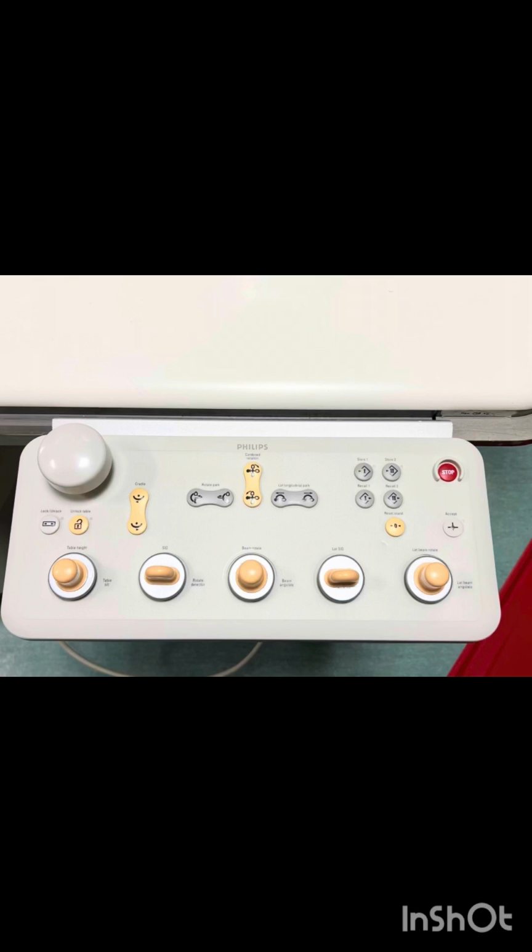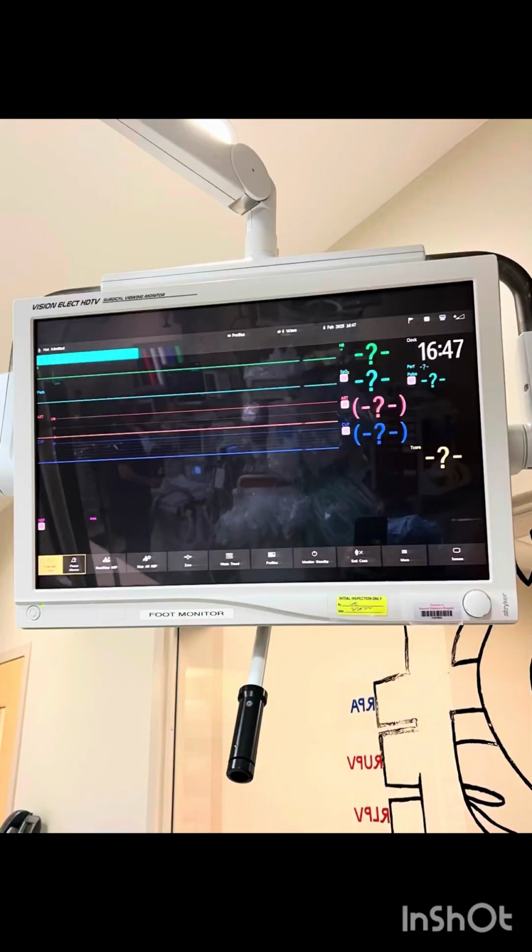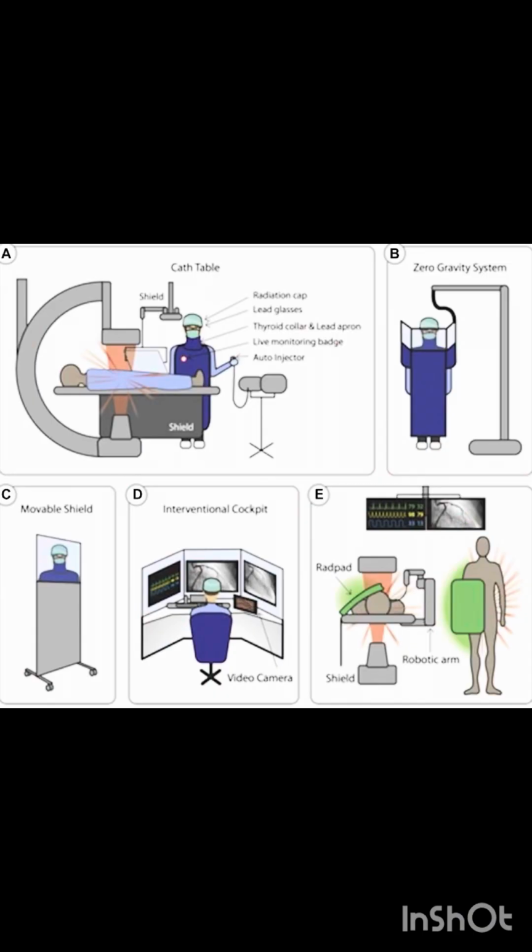Simple awareness and monitoring could reduce exposure. The article recommended providing left-sided lead shields, protective lenses, and modifying staff positioning during procedures. It concludes that further research is needed in order to grasp a better understanding of the impact from real-time radiation exposure and to improve protective practices.